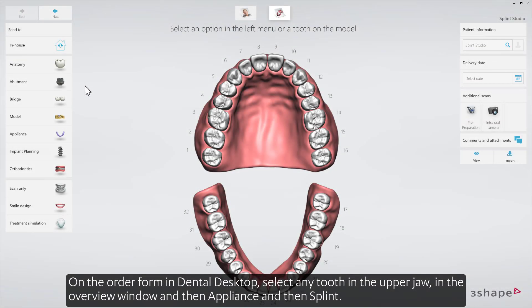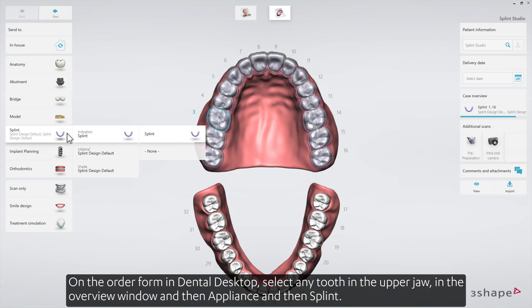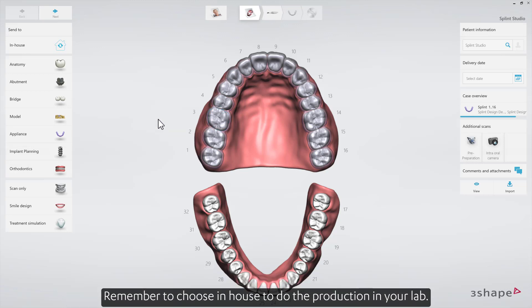On the order form in Dental Desktop, select any tooth in the upper jaw in the Overview window, then Appliance, then Splint. Remember to choose In-House to do the production in your lab.